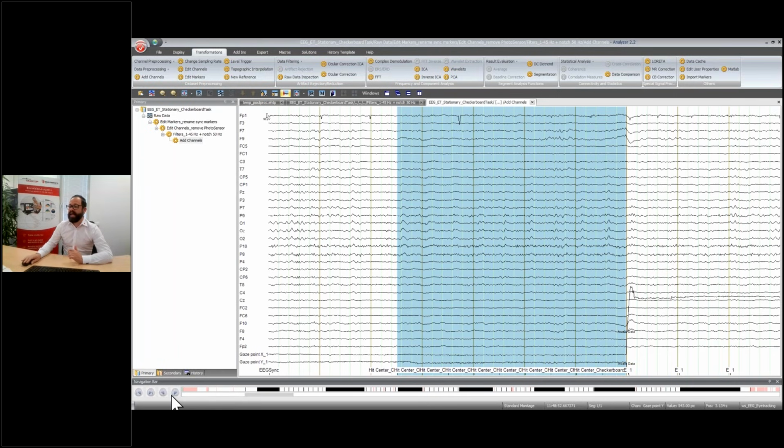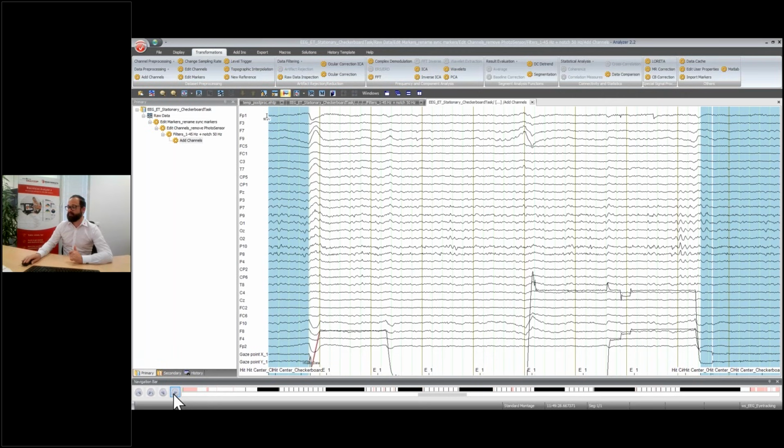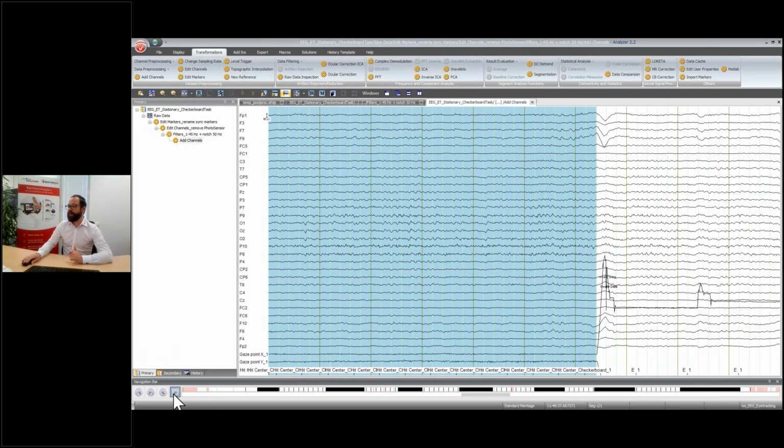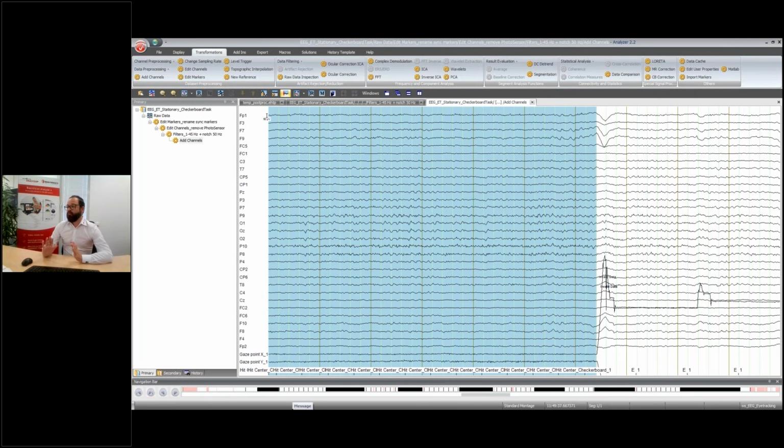So what we have is AOI hits for consecutive stimuli, and then we have misses for consecutive stimuli. What we want to do now with the analysis is create an ERP that just includes all of these trials inside of the blue markers and not those outside. We will just drop those. Okay.